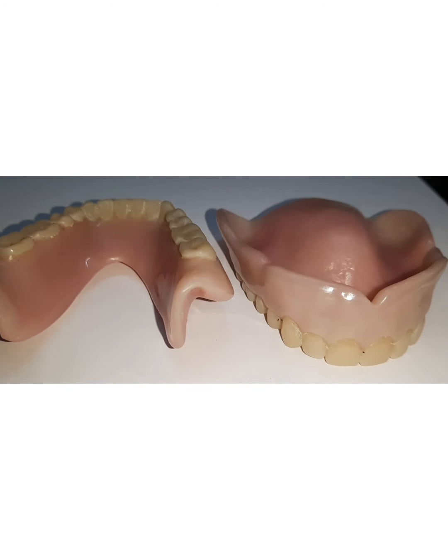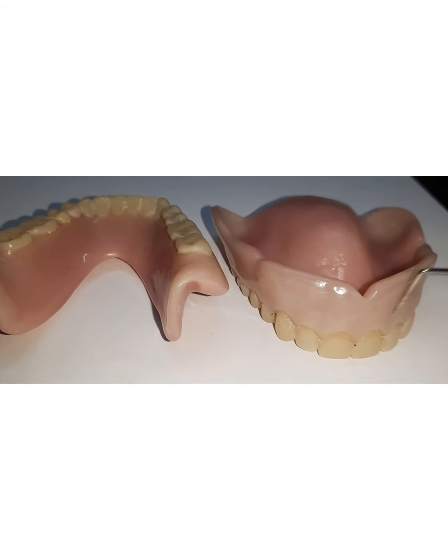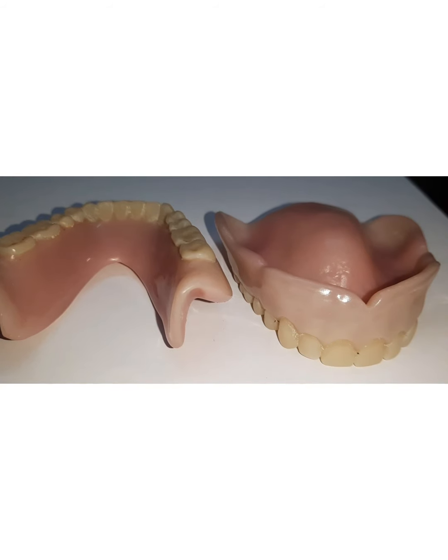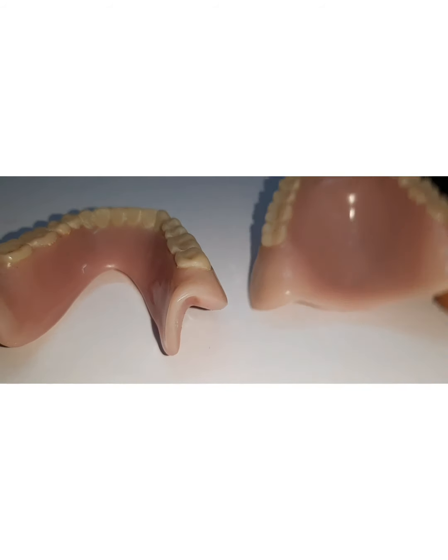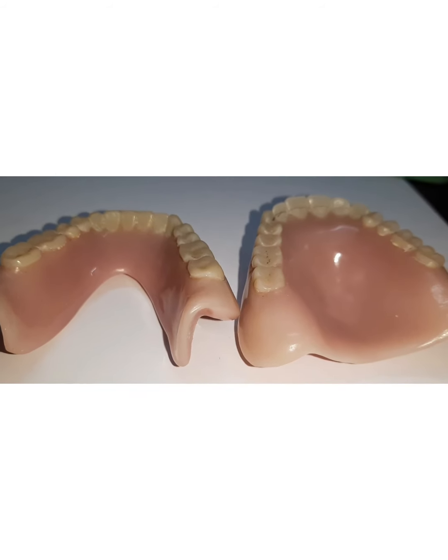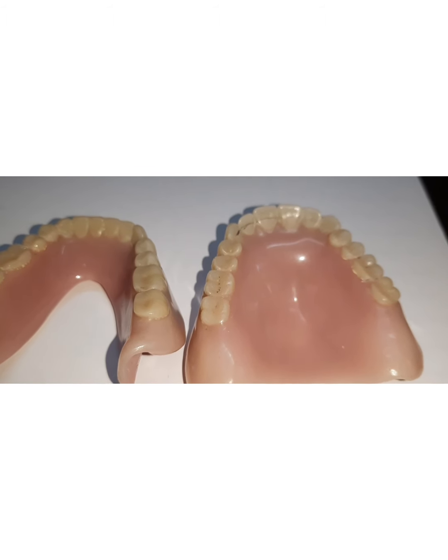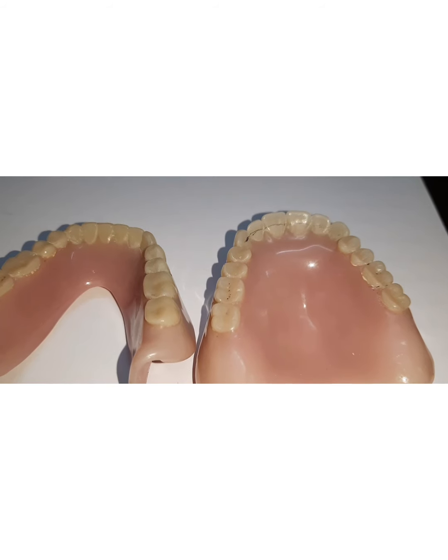So this surface includes the labial surface, the buccal surface, the lingual surface and the palatal surface. This is the palatal surface. As we said in the definition also, this surface should be highly polished, and that is the reason it is called the polished surface.